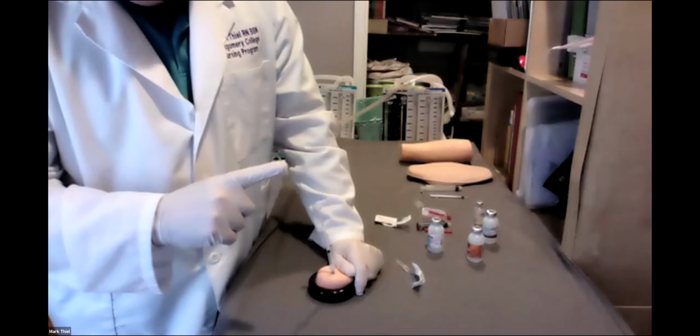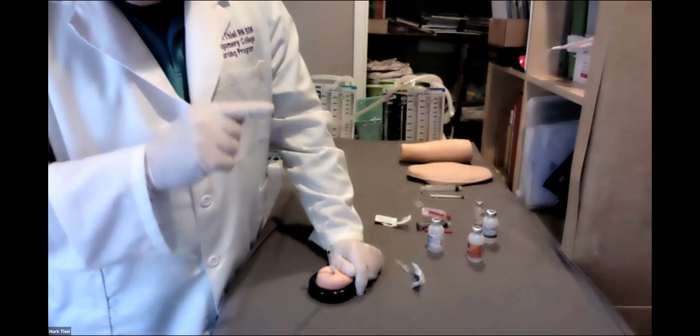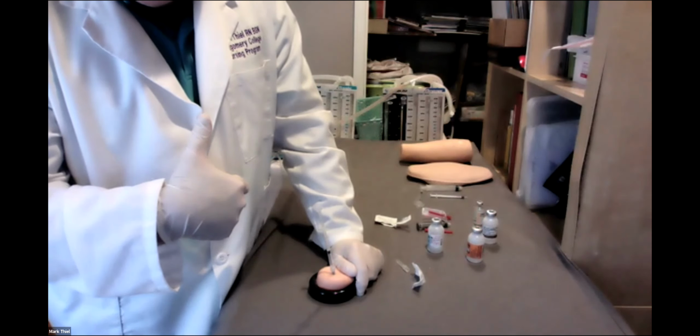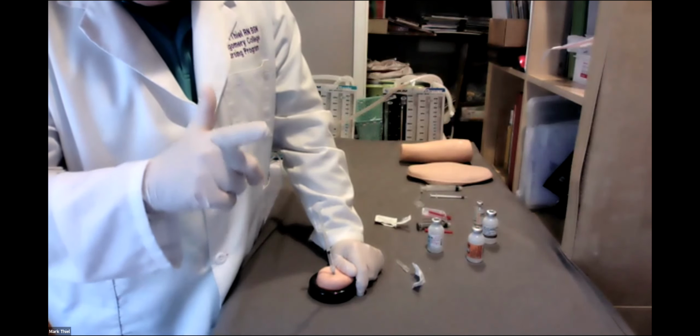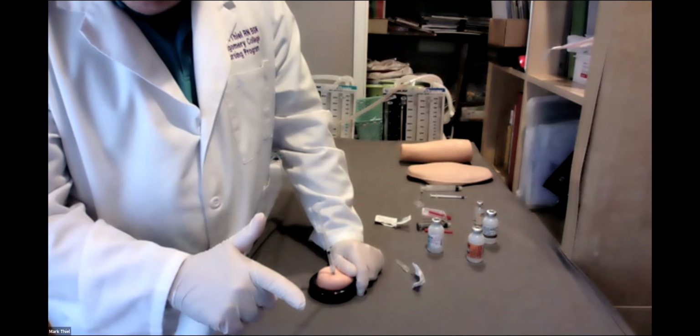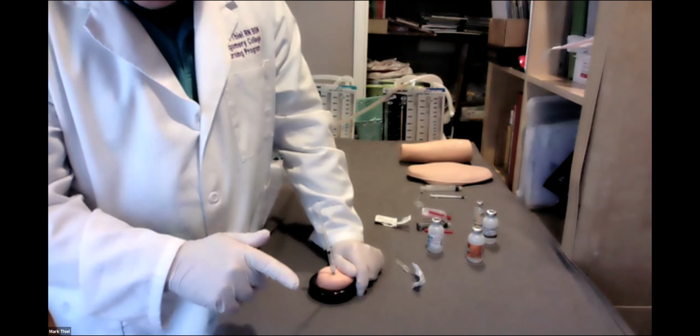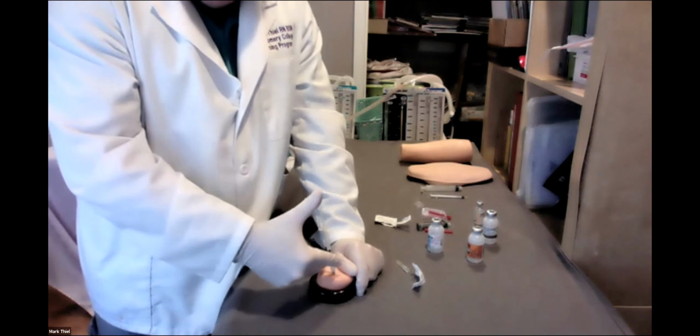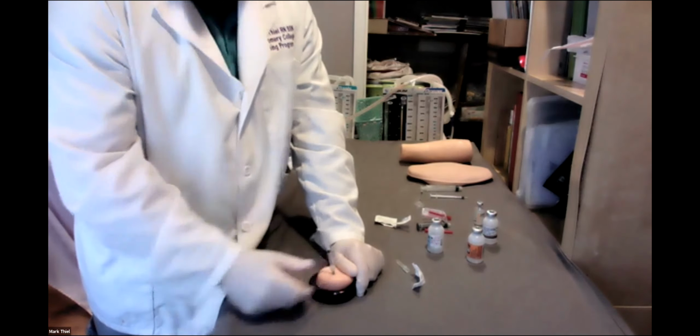The designation is 1 mL, count to 10. Today we had what? 0.5, we count to 5, right? Per tenth of a mL over those amount of seconds. We don't go boom.